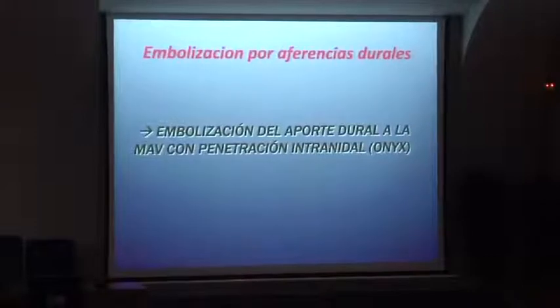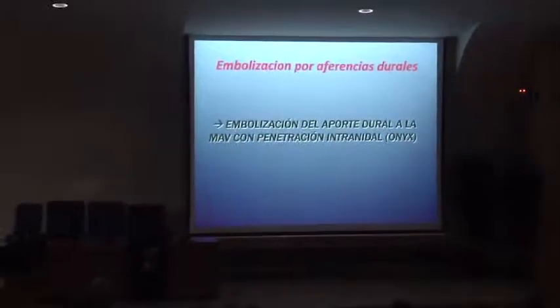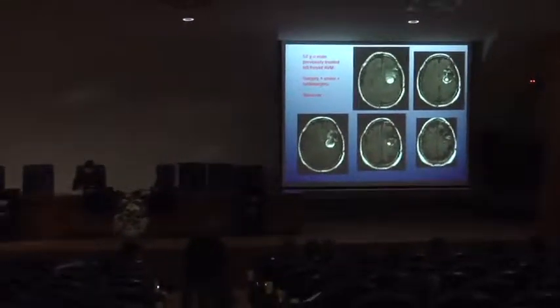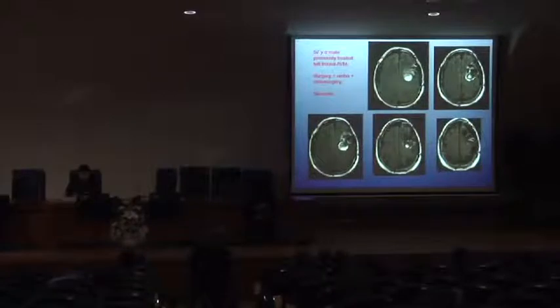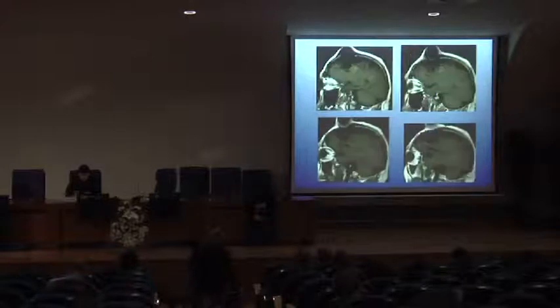another comment is, why not attack the AVM with the dural approach? Next. This is a patient treated 20 years ago with neurosurgery. I have a big AVM, I have an aneurysm, it is very complex. He comes to the hospital with status epilepticus, very difficult to control.